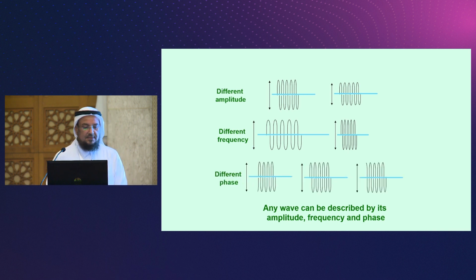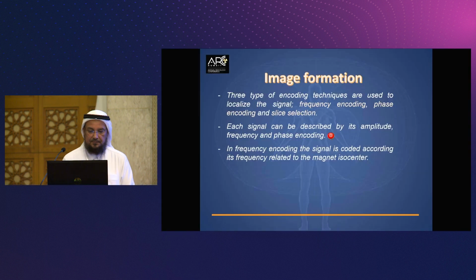The third one is the phase. So this has a -1 phase, meaning that it does not start opposite to the antenna. It's far from the antenna, like 90 degrees. This starts from opposite to the antenna, and this is, again, clockwise positive. So they have similar amplitude, similar frequency, but different phase. So we will try to utilize this information, variation between the signals, to give a label to the waves.